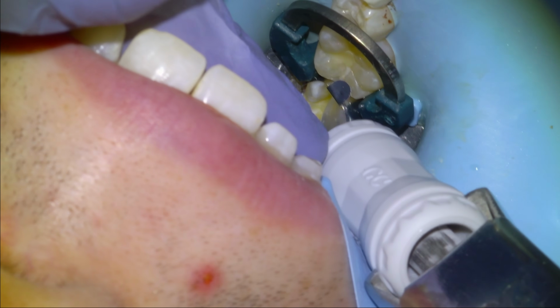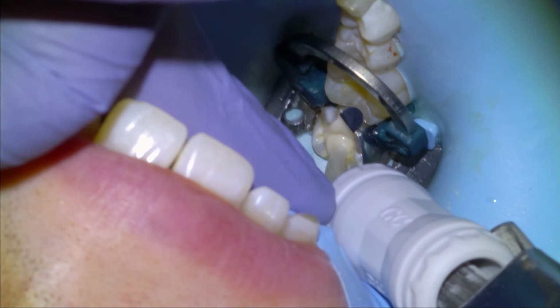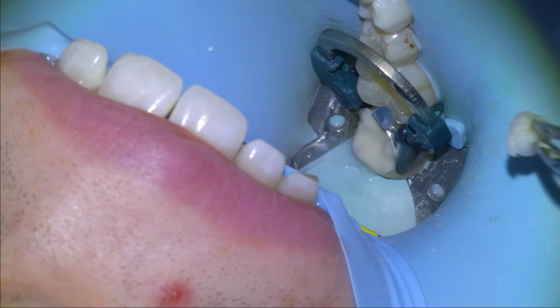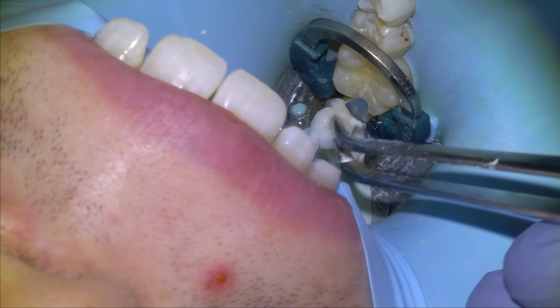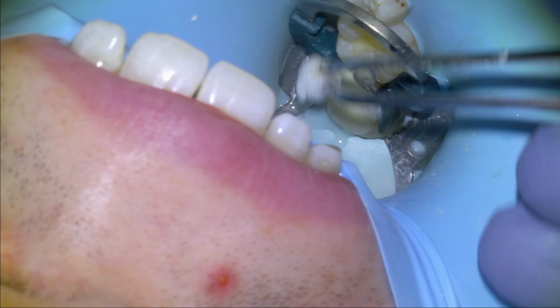And we're going to express our Equia Forte into the proximal box first, and then overfill the tooth. I'll pack it in with a moist cotton pellet to ensure that there is good adaptation around all of the margins of the cavity.